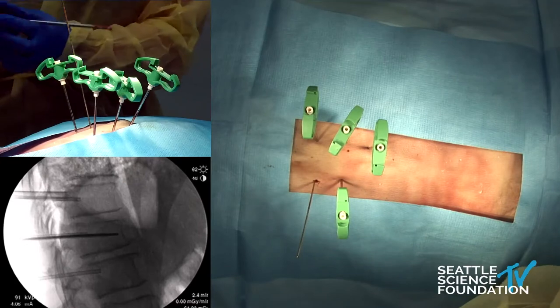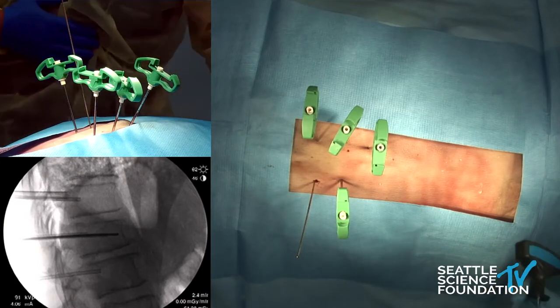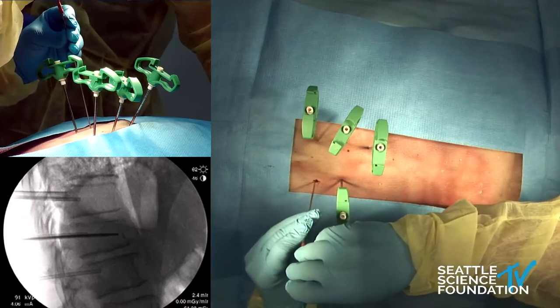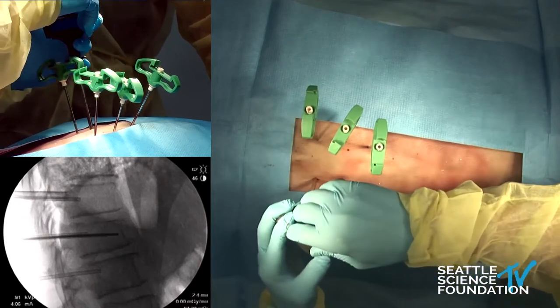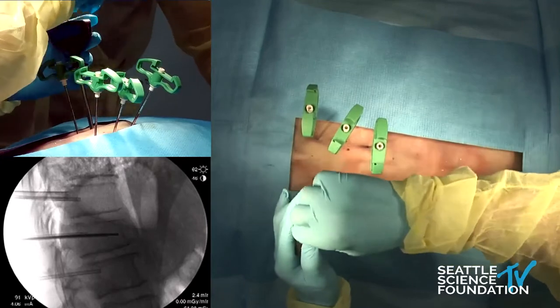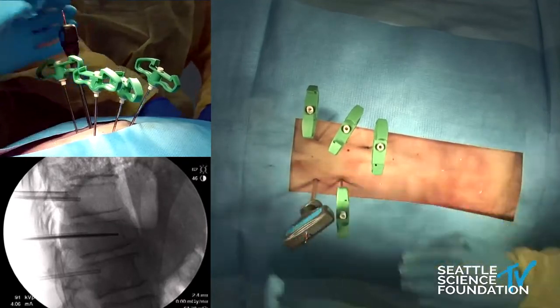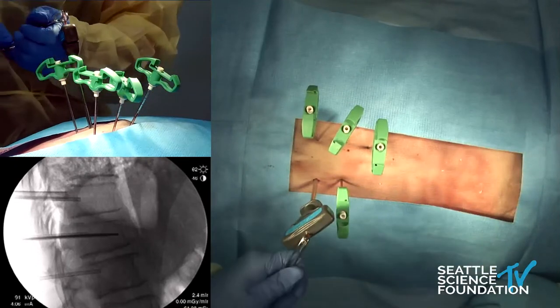I also wanted to thank Stryker for helping us with all this instrumentation and helping us to put on the course today. As we're placing, we want to be mindful of this wire.